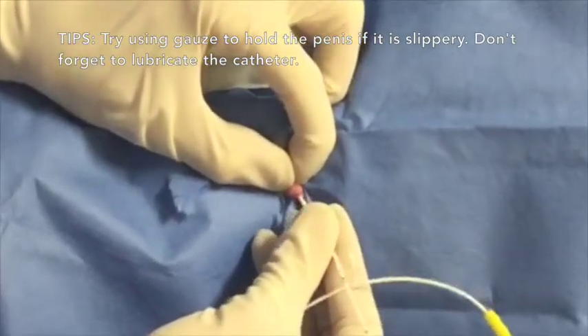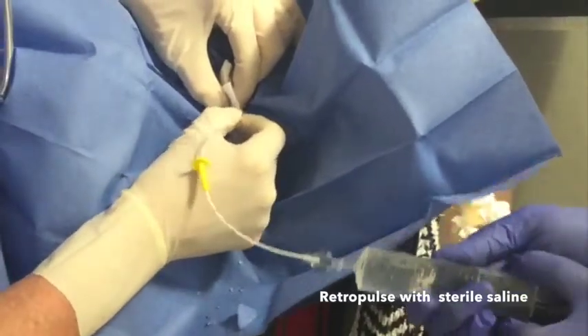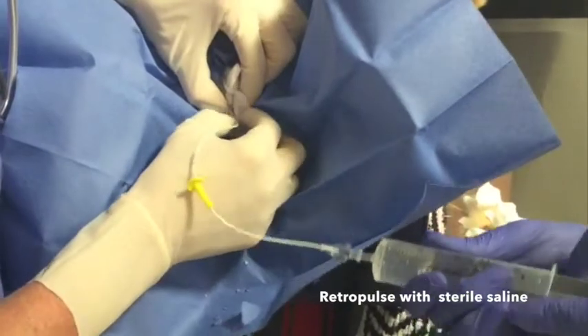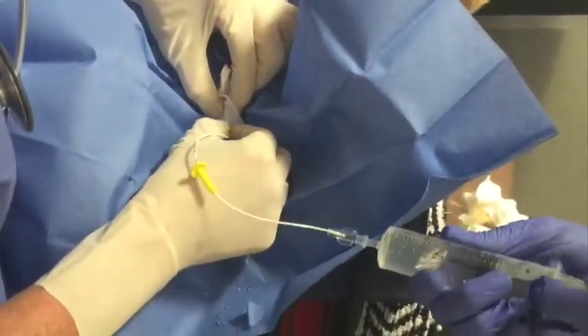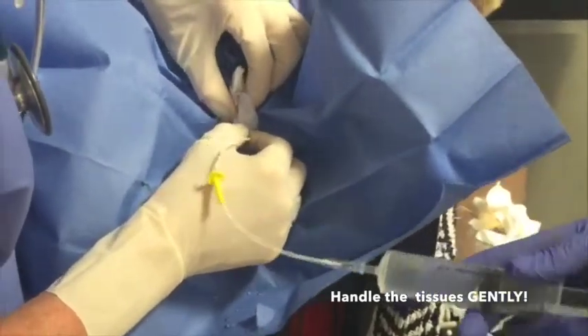If you encounter an obstruction, you may need to retropulse that material back into the urinary bladder by flushing sterile saline. You can apply gentle pressure to the penis to occlude the distal urethra around the catheter while your assistant flushes with the sterile saline. I find that pulsing with the flush is most effective.